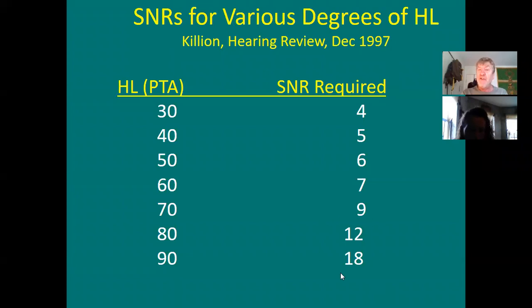And that's why when someone has a severe hearing loss, like here shown on the left, directional microphones are no longer any good. They're not going to help the person much. That person's going to need an FM system, or a separate microphone worn by the person sitting across from him or her, so that he or she can get Bluetooth pickup with their hearing aid, okay? That person's going to need more than a directional mic.